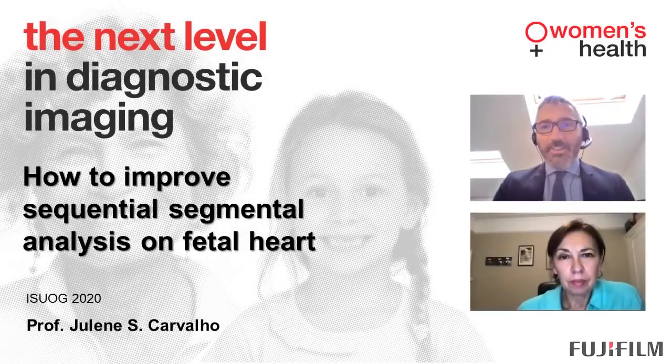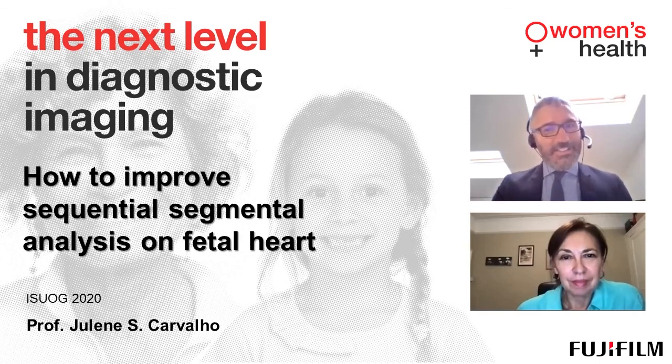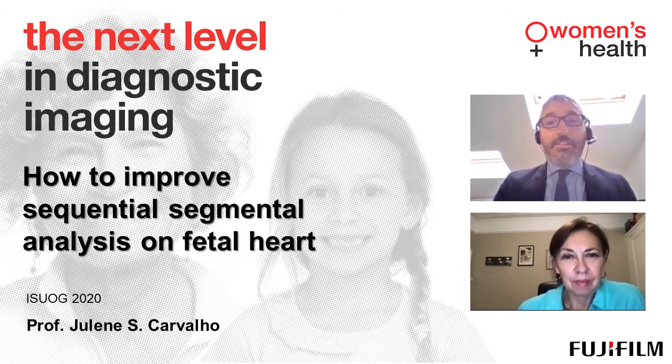Dear Professor Carvalho, thank you very much for the lecture. It was really interesting. You gave a very nice overview of the possibilities of how to improve the sequential segmental analysis. So we saw a lot of nice cases and tips and tricks on how to improve this fetal scanning.